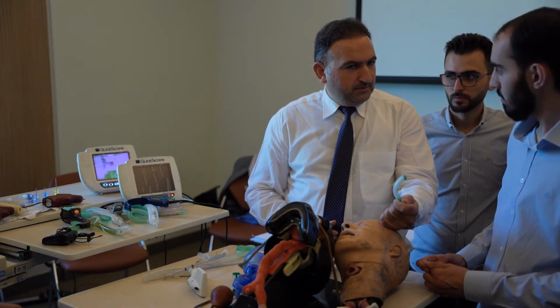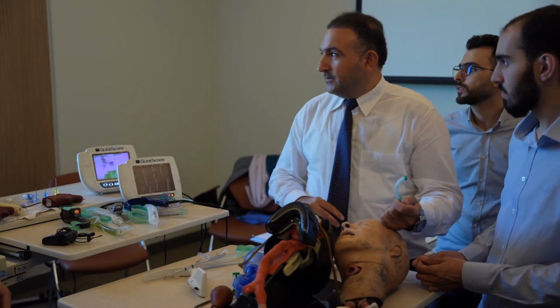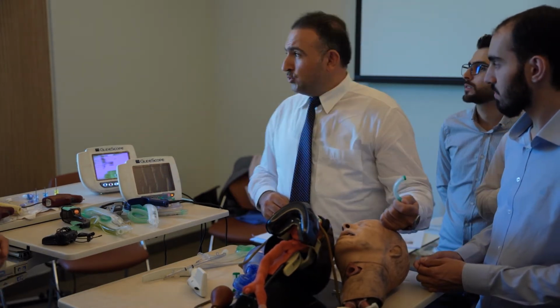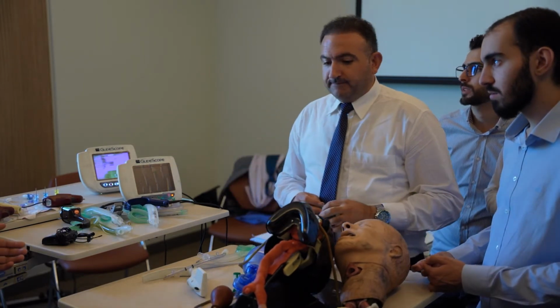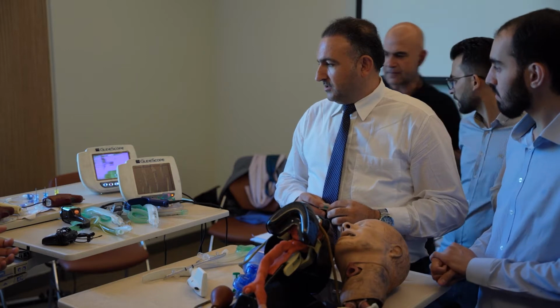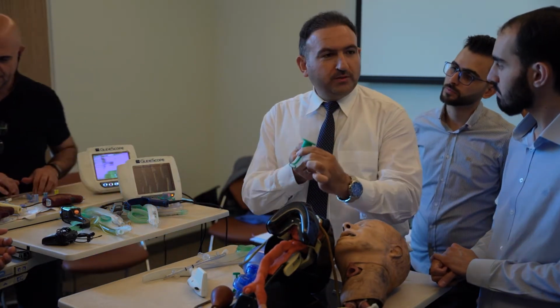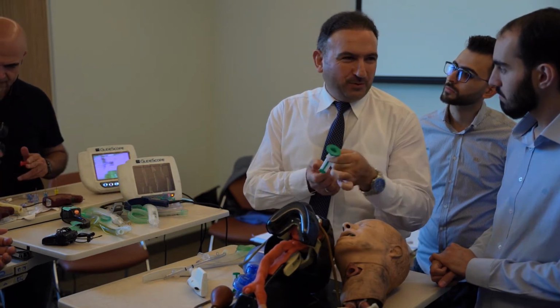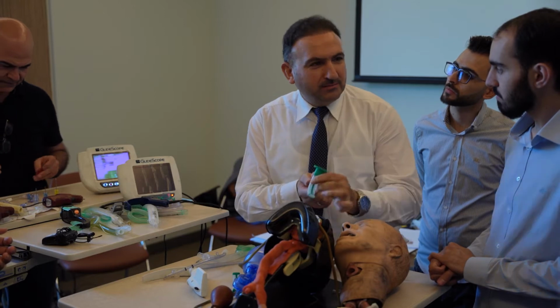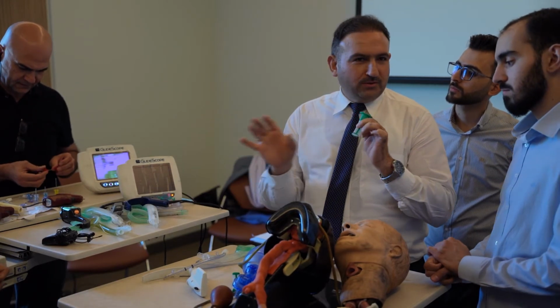If it's the only one? Yes. Why not? You should put it. No. If it was the only one, I tell you what. If it's a small size, we will push the base of the tongue, and we will close the airway. So you'll add further harm to the patient. And what will we do? Bag valve mask. What will you do? No, bag valve mask must be used.